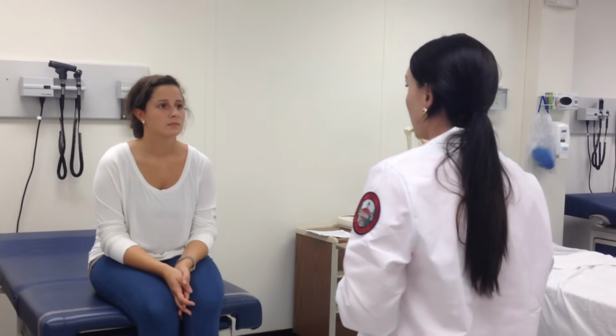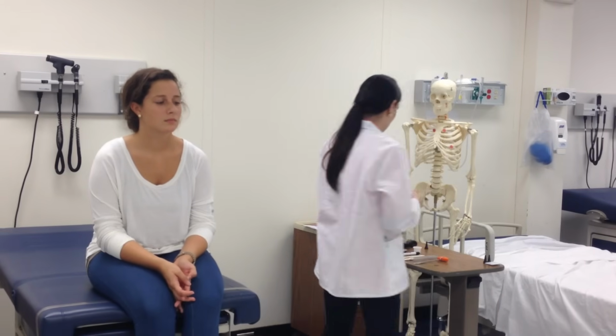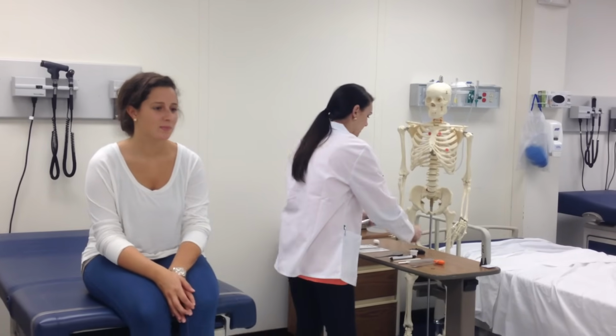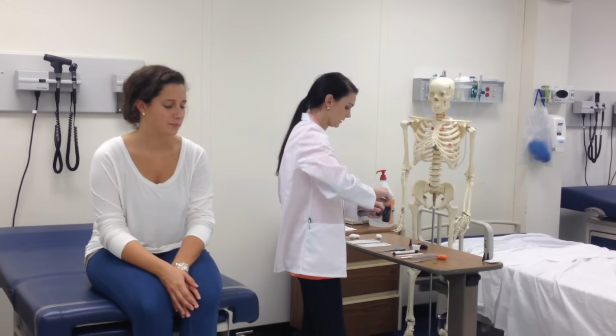We're going to go to your nose. Your nose is midline. There's no obvious lumps or lesions. We're going to look inside of your nose. Let me just get my equipment ready. Are you doing okay? Yeah. Okay, good. Let me know if you have any discomfort or if you have any questions about anything. Okay.